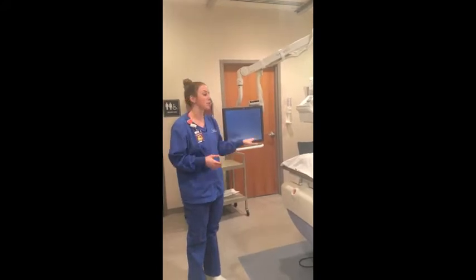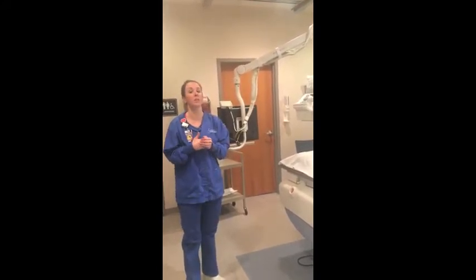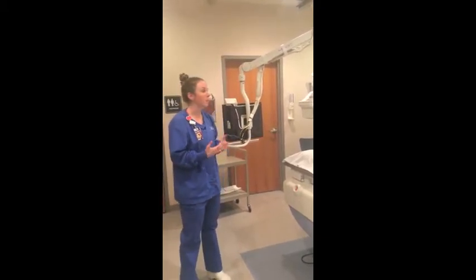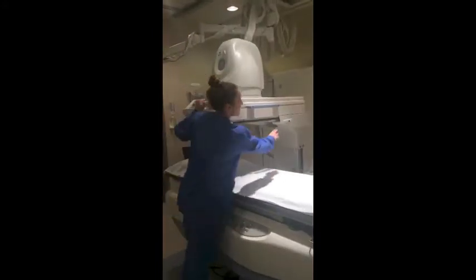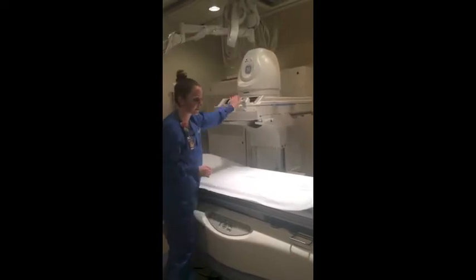Okay? Once the procedure is finished, it's really important for you to face it the opposite direction due to HIPAA violations. It will show the patient information on it. And then once you're finished, make sure that you push the tower all the way back and then depress the handle down until the tower locks into place.